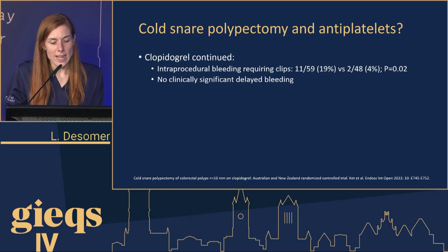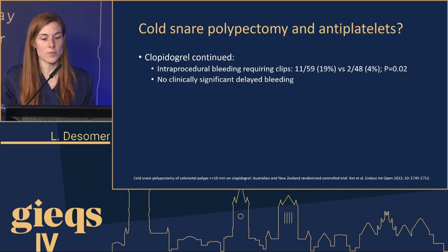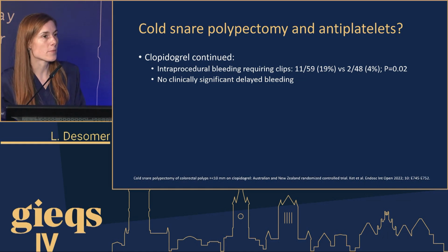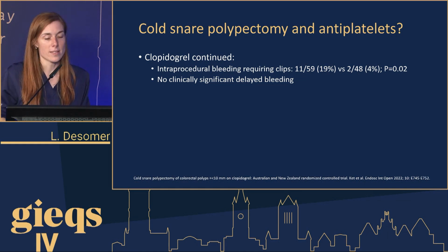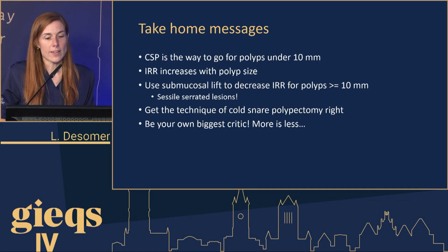There is a study on antiplatelets as well from Australia and New Zealand, and they had a group where they continued clopidogrel and stopped clopidogrel, and actually the intraprocedural bleeding was higher, but not the delayed bleeding. And I think that's an important message, that you apparently don't really have to worry about clinically significant delayed bleeding after cold snare polypectomy.